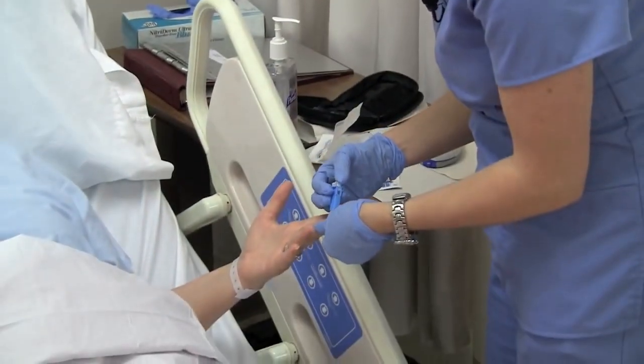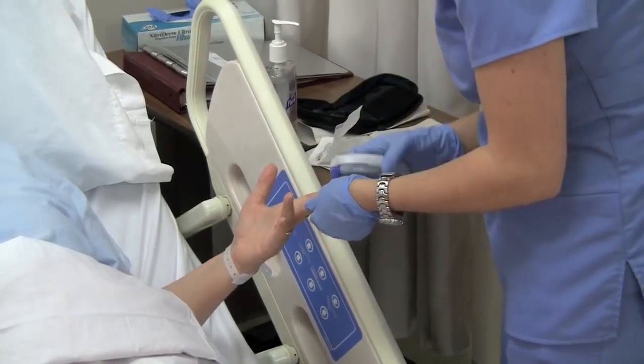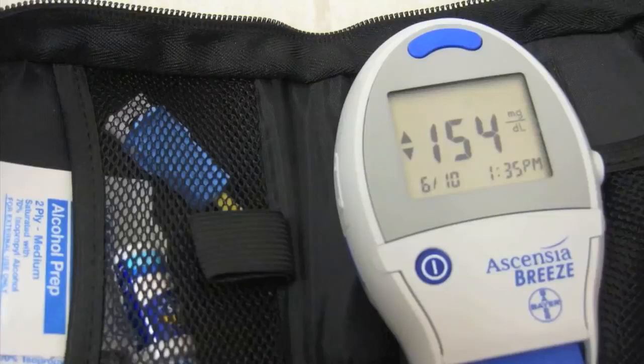Okay, Alma, you're going to feel a small prick here. Your blood sugar is 154. I'll need to get you some insulin.